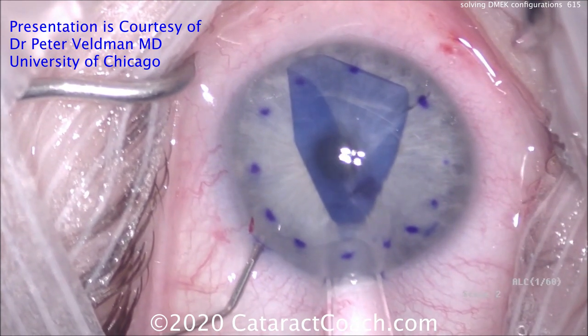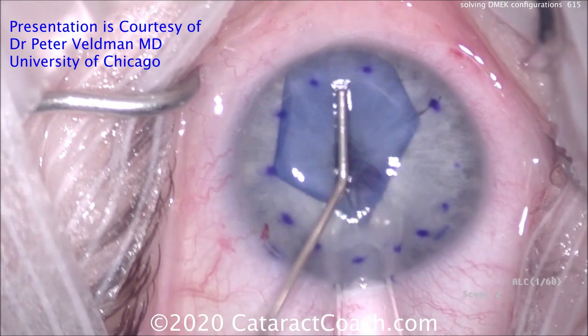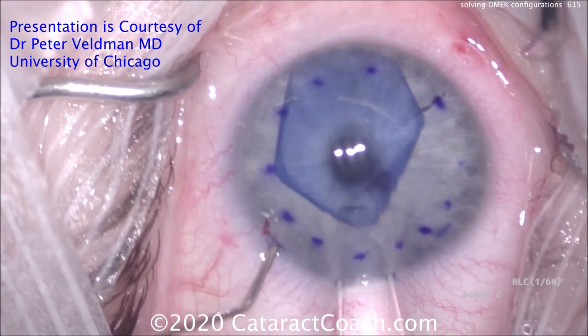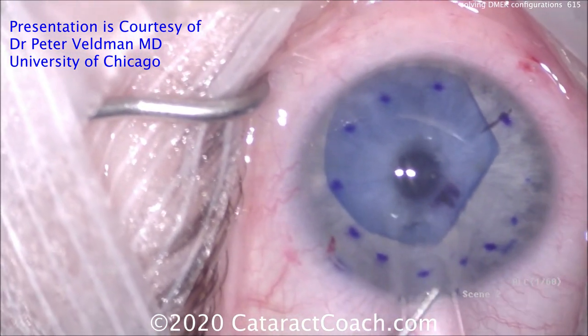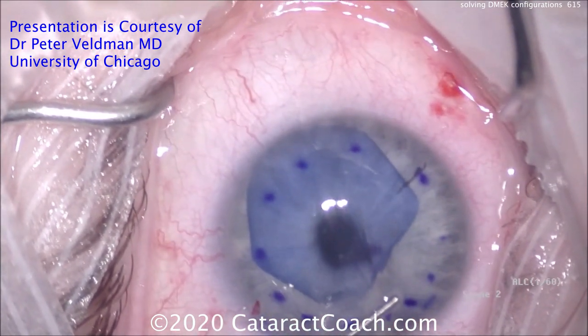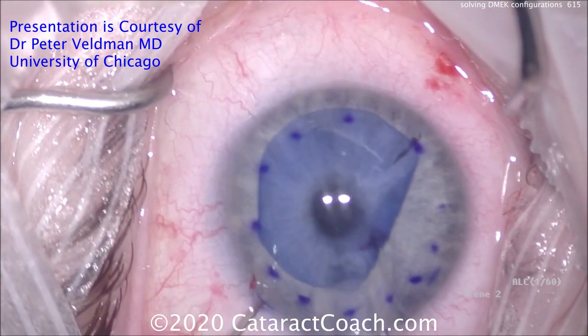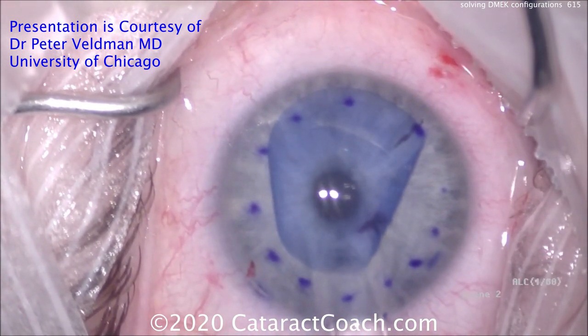Flatten out the anterior chamber a little bit more, tap in the center, and look how that graft just opens up. A little bit more tapping. That looks good — unfolding the edges. Now just going to tap it over into position. You see the letter F there. That F mark shows the orientation is correct. The graft is in its correct position, not upside down.